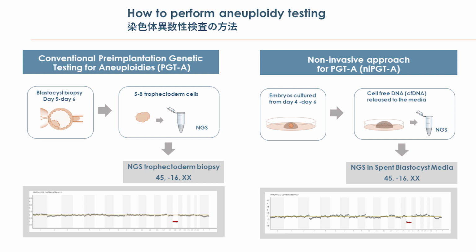And by applying the same technology, next generation sequencing, these are results from the same embryo, biopsy and culture media drop. The results are very similar. We can also observe the monosomy for chromosome 16.